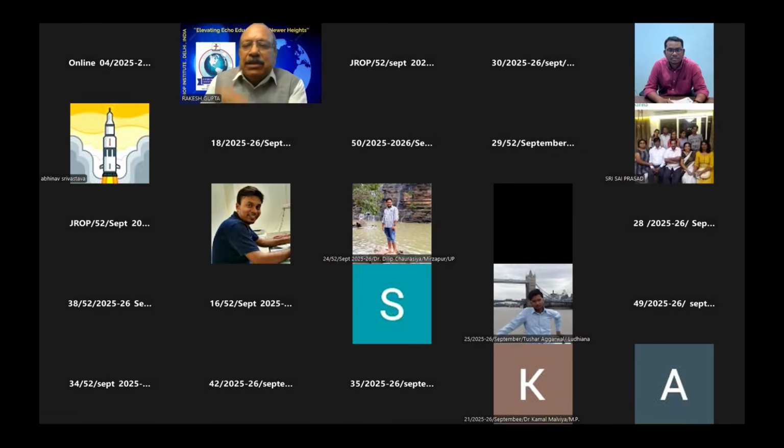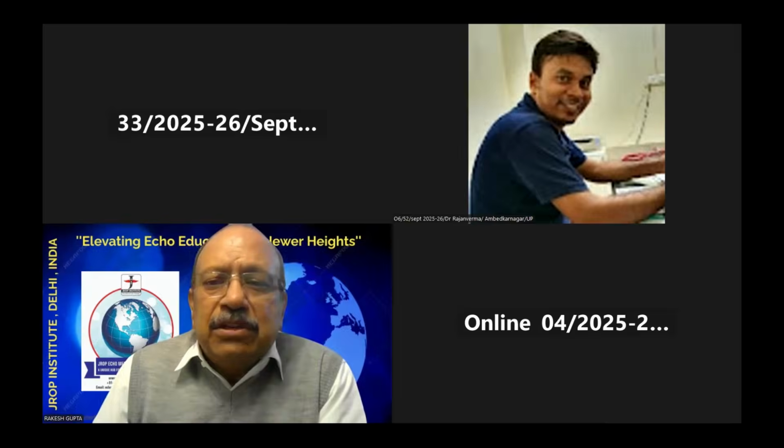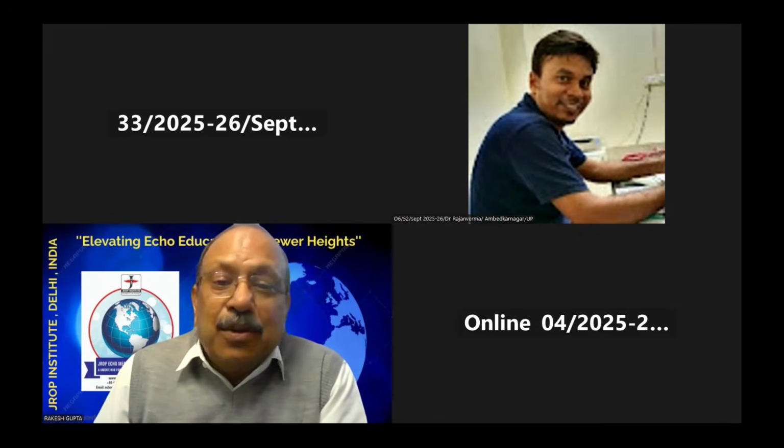Let's start raising your hands. And meanwhile, let me just find out that patient of a degenerative mitral valve. I did load it here.